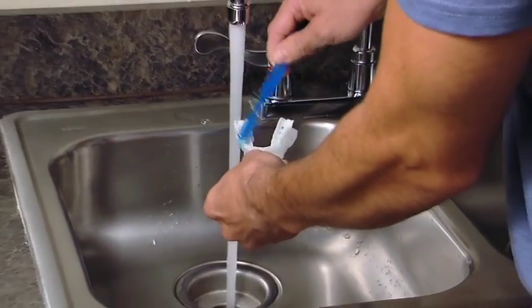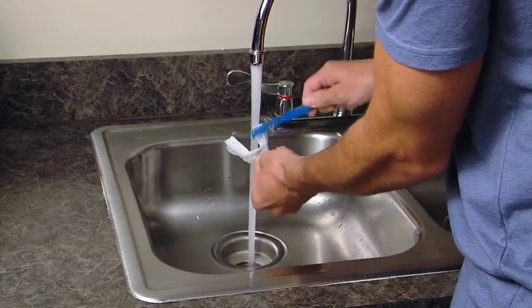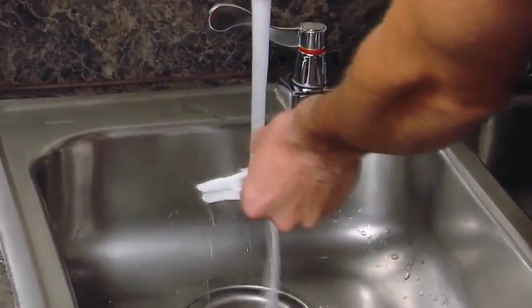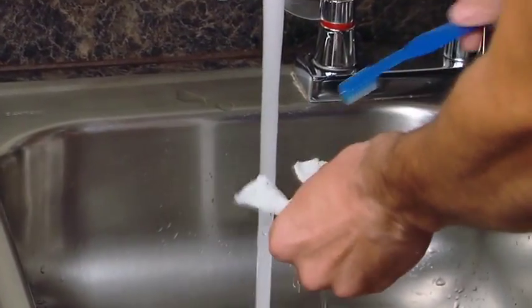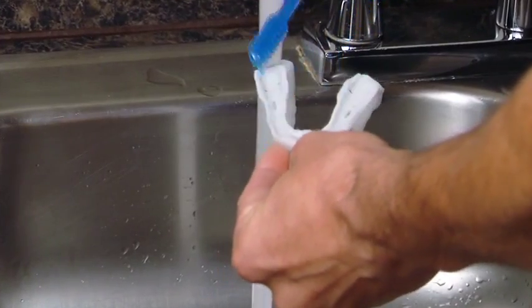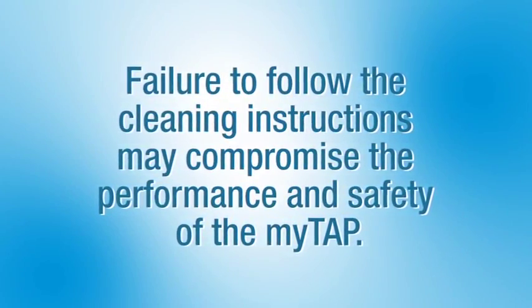After each use, thoroughly clean your myTAP using a toothbrush in cool water. Clean the trays weekly or less as needed with lukewarm water and mild soap. Let it dry thoroughly. The appliance is made from heat-sensitive materials and should not be stored where temperatures exceed 120 degrees Fahrenheit. Failure to follow the cleaning instructions may compromise the performance and safety of the myTAP.